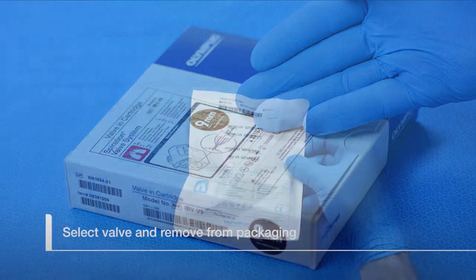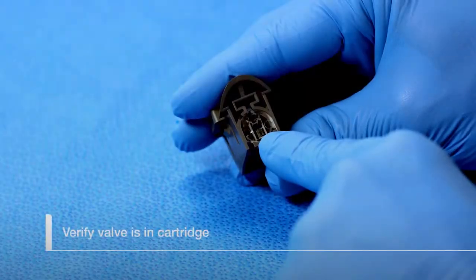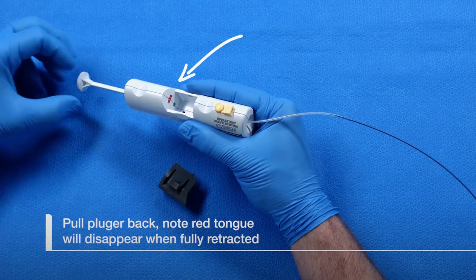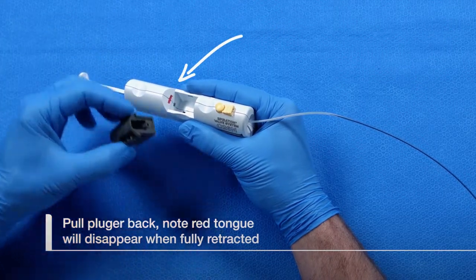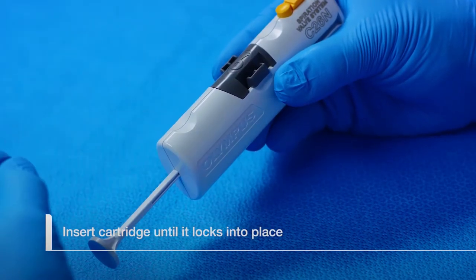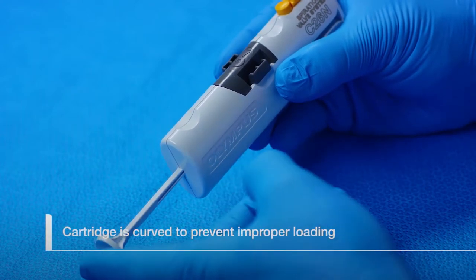Select a cartridge of the determined valve size and remove it from its packaging. Verify the valve is inside the cartridge. Pull the loader plunger all the way back, noting that the red tongue inside the loader will disappear when it is fully retracted. Insert the cartridge into the loader until it locks into place. The cartridge is curved on one side to prevent improper loading.